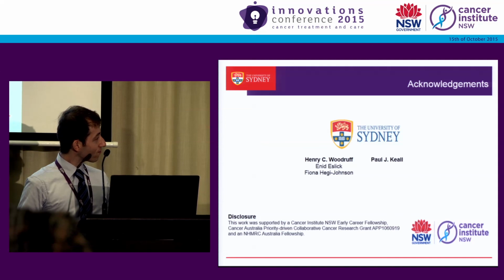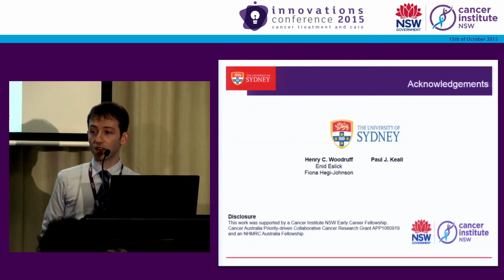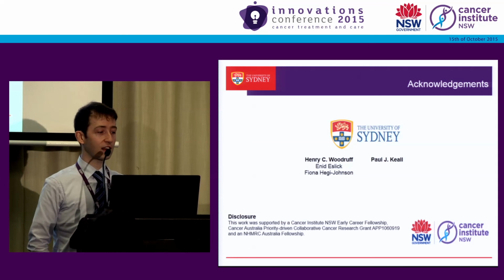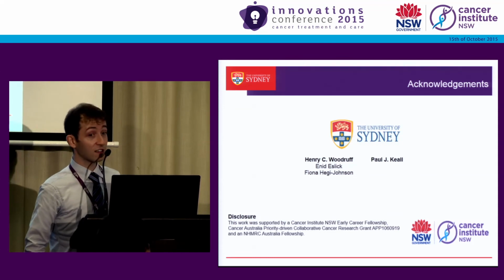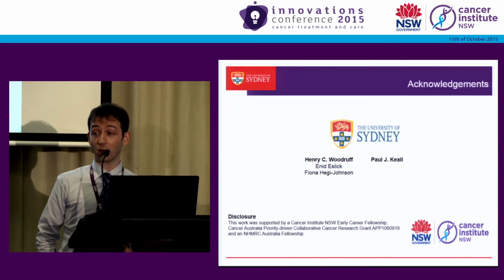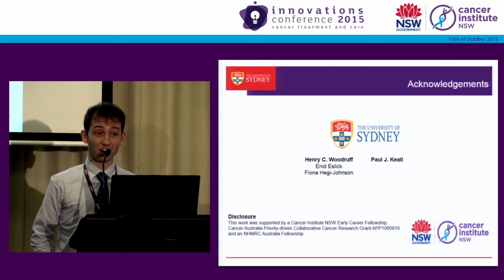I'm wondering if there's anyone else in the world that might be looking at the way that you're analysing the data. Actually, there are quite a few groups, both in the US and Japan and Europe now, correlating CT ventilation-based functional dose volume parameters against other imaging modalities, but also clinical measures of function, so spirometry-based FEV1 or FVC, also looking at clinically graded toxicity outcomes.